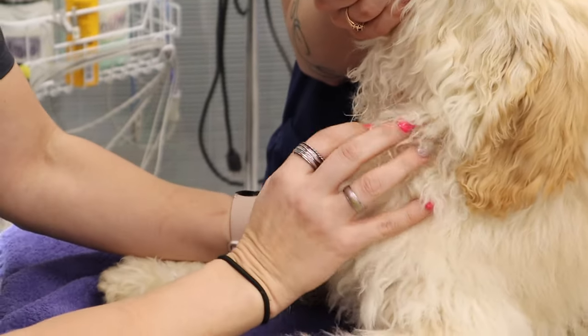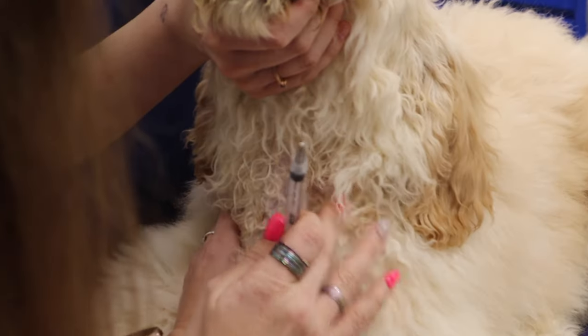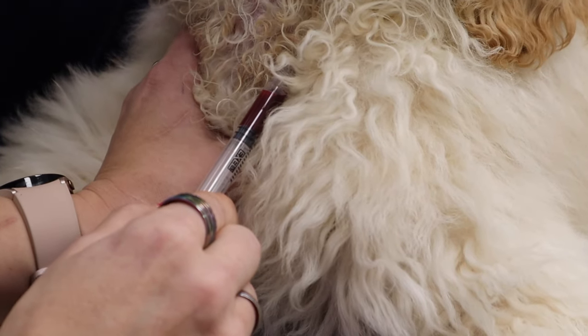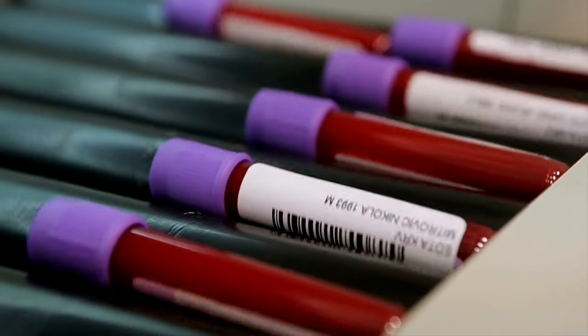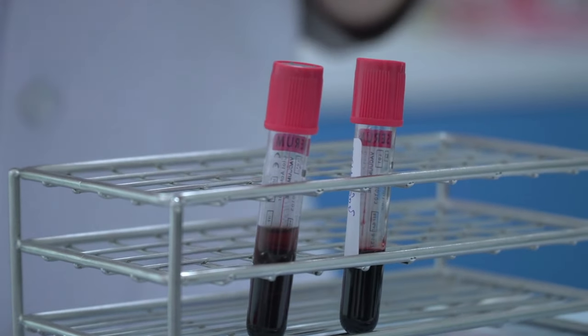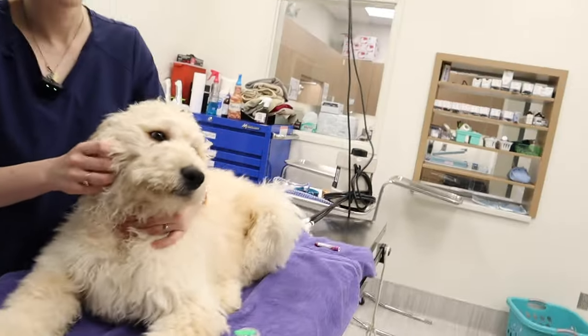Then we're going to go ahead and locate that vein on the neck and palpate for it. We're going to take our needle, make sure we have our bevel up, go into the vein, and draw back the blood that we're needing. Once you get your blood sample, you're going to go ahead and do a purple top, maybe a green or a tiger top. With the purple top, remember you need to get that blood in there right away because if it clots, the purple top is no good. Also, you need to be rotating it to make sure you don't have any abnormal platelets or CBC counts when you're all done. Keep in mind, you want to be gentle when rocking it — don't shake it aggressively because that can damage your sample. Like any blood draw for any animal or person, gentle pressure held after the draw will prevent bruising and any bleeding from that site.